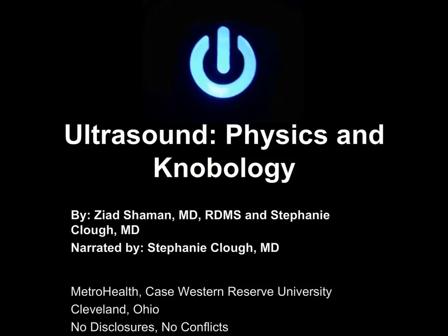Ultrasound has been in use in medicine for over 60 years and is currently one of the most widely used diagnostic tools. Historically, ultrasound has been the domain of radiologists, but thanks to the emergency medicine physician, that domain has broadened with the revolution of point-of-care ultrasound. Now, ultrasound-guided vascular access and thoracentesis is considered standard of care all over North America. The availability of handheld or portable ultrasound devices able to produce excellent image quality while being user-friendly has made ultrasound's transition for use by the intensivist practical.